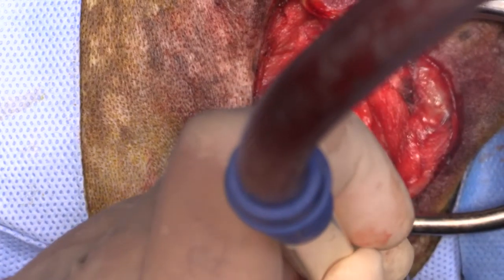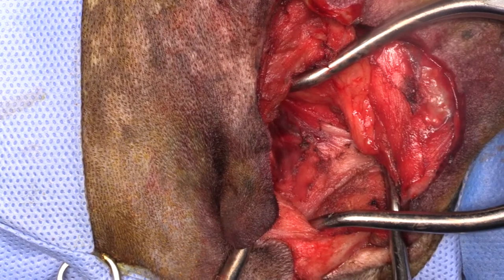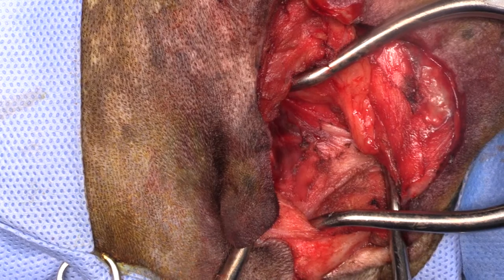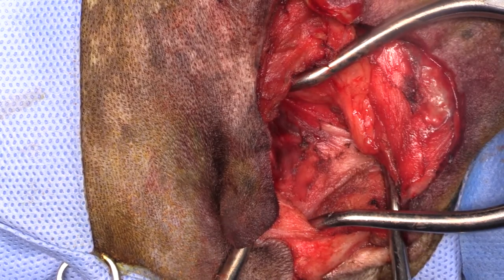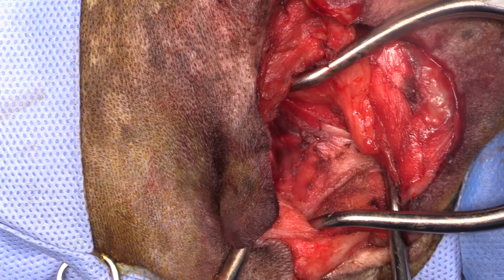What's that? Yeah, that yeah. No, it's all good. The Doberman has a little bit of necrotic tissue, or? I think so, yeah. So we're going to have to trim out that necrotic tissue. Mm-hmm. And sorry, guys, I'm just looking at some photos on another patient. Probably have to admit it, trim that out, and then rebandage it and let it heal by second intention.